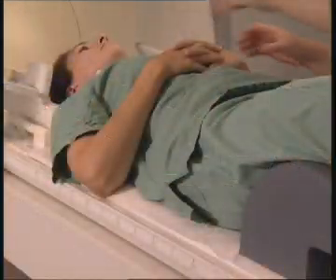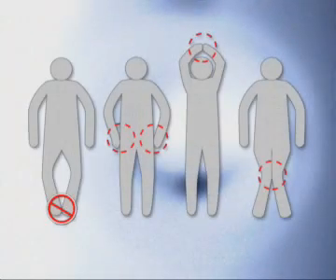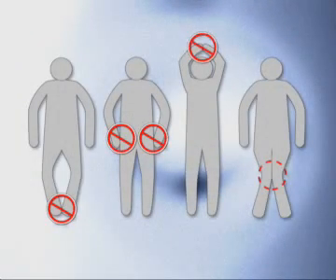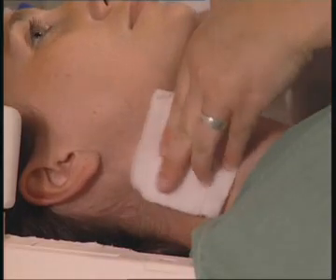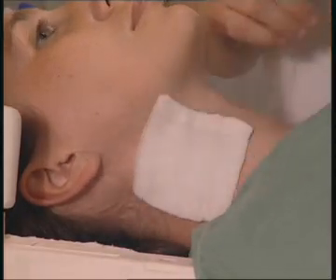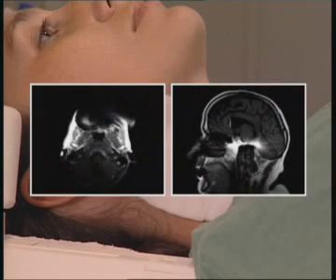The patient should be positioned so that the legs and hands are not touching. They can form electrical current loops that act as antenna for the RF energy. Local burns may result. Permanent makeup, tattoos, and tattooing on the body must be documented and can be covered with damp compresses. Although this type of body decoration is not a contraindication, the patient must be informed that heating or distortion effects may result in the corresponding area.